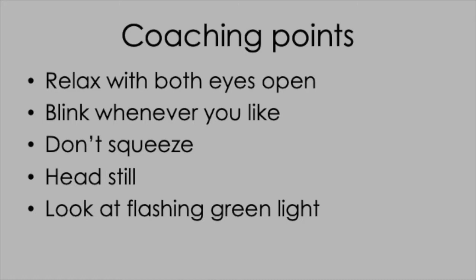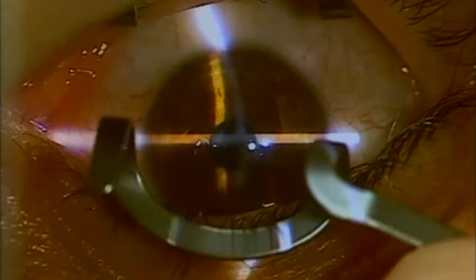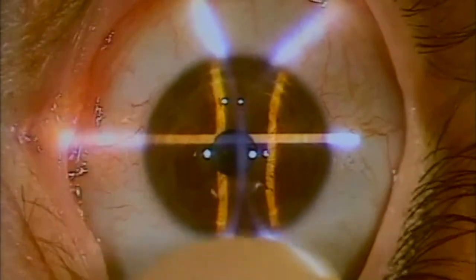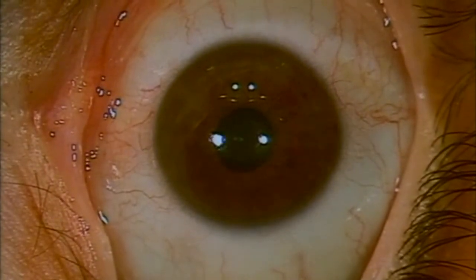It's worth telling the patient that the fixation light may get a bit fuzzy as the procedure progresses and as they start to smell the ablation product. Your main aim then is to preserve a uniform tear interface at the start of ablation. So we're holding the lids apart with no speculum to do the registration locking, then bringing down the environmental control system, allowing the patient to blink freely, and then just slipping the speculum in, encouraging them to keep both eyes open — in particular the contralateral eye, that's the trick to stop them squeezing — locking on the tracking and then we're ready to go.